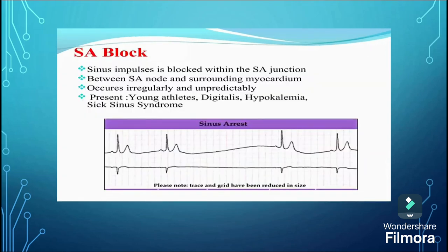Then SA block. Sinus impulses are blocked within the SA junction, between the SA node and surrounding myocardium. Occurs irregularly and unpredictably, present in young athletes, digitalis, hypokalemia, sick sinus syndrome. So this is the sinus arrest.